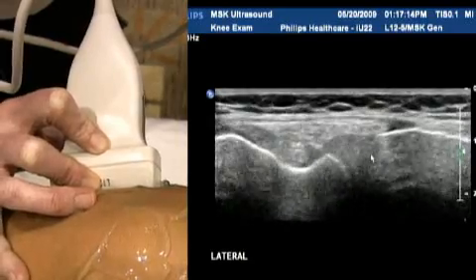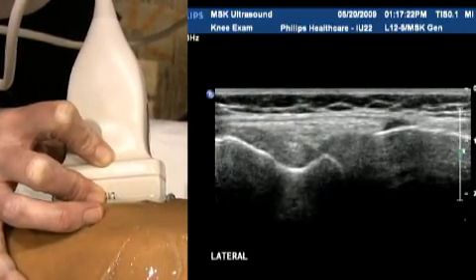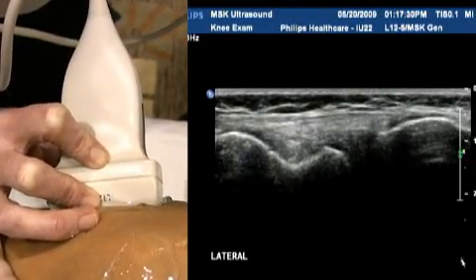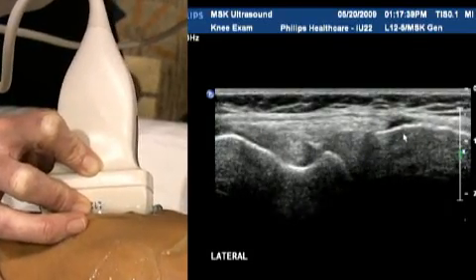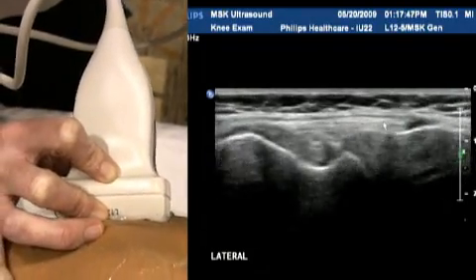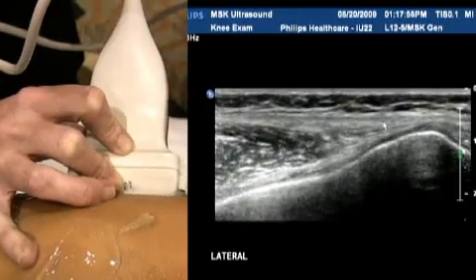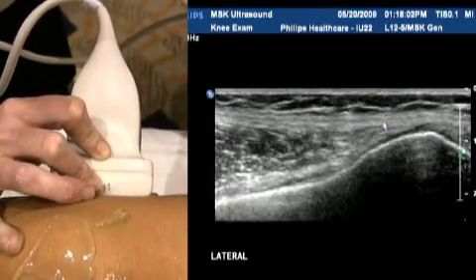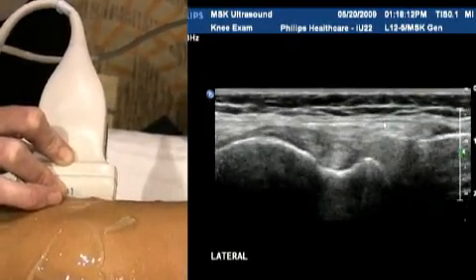Having a look further afield and assessing the entire lateral knee complex using the full range of the transducer — about five centimetres — lying above the lateral meniscus, you see the lateral collateral ligament sitting just above. Again you're assessing that for integrity, making sure it's intact. Above that you're seeing the iliotibial band, which attaches distally at the knee but extends all the way up to attach onto the hip. Whenever you're assessing the iliotibial band, be really cognisant of patient history and ascertain whether it's a distal or more proximal iliotibial band issue, right up by the hip.